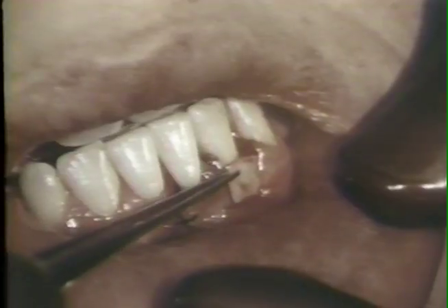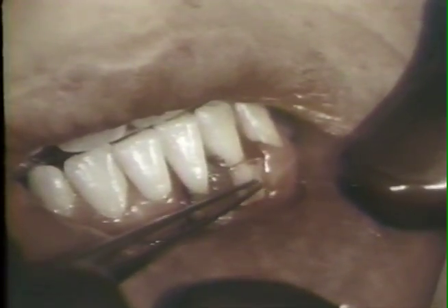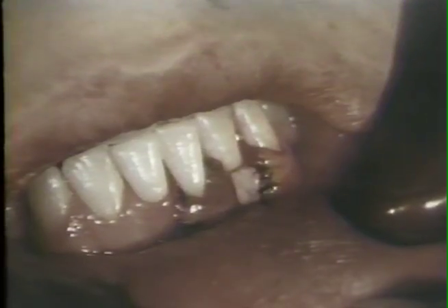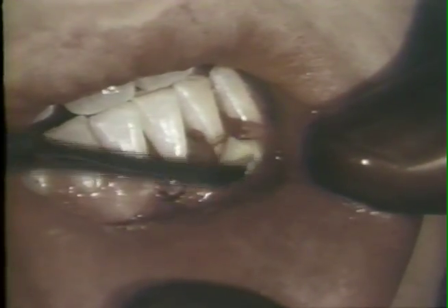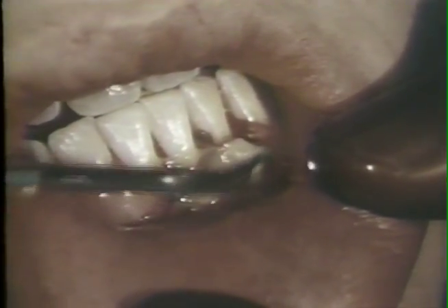The dressing is locked interproximately between the teeth using a plastic instrument. The graft is placed over the periosteal defect following the laterally positioned flap procedure, and sutured to the distal wall of the surgical defect with 5-0 silk sutures. Both the free graft and the lateral sliding flap have been held in position for a couple of minutes with a piece of gauze moistened in sterile saline solution. It is important to have a viable periosteum under the free graft for a take of the graft; therefore, a split flap procedure was used. It is also assumed that there is less resorption of the thin labial bone following a split flap procedure rather than a full flap procedure.